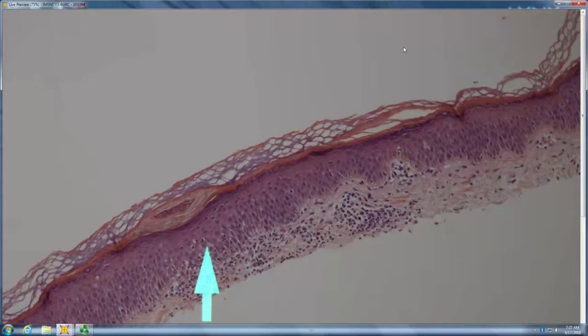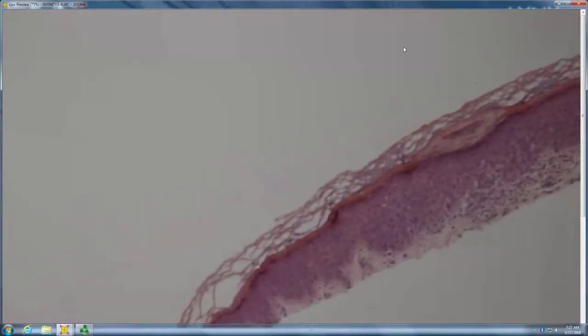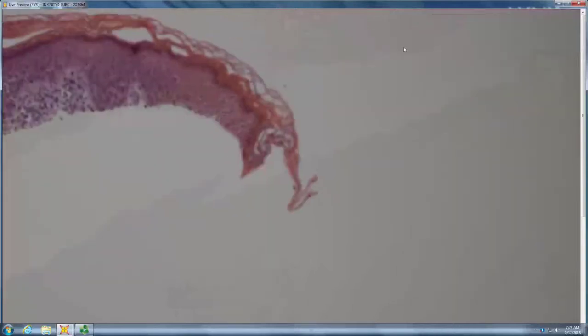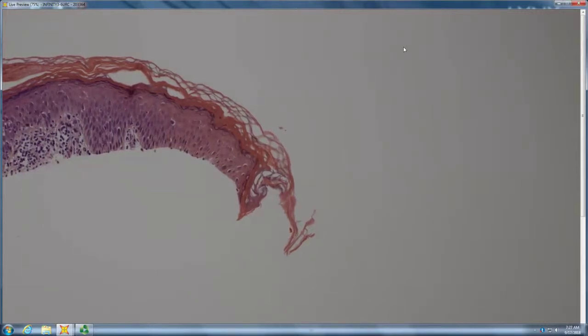I'd say vacuolar again. I'd go more spongy, honestly. Okay. And that pattern of the horn just seems to continue everywhere, right? Kind of has a tinea pattern. Okay, it's very much a tinea pattern. And tinea, remember, can look like anything. It's commonly spongiotic. Occasionally can be interface.